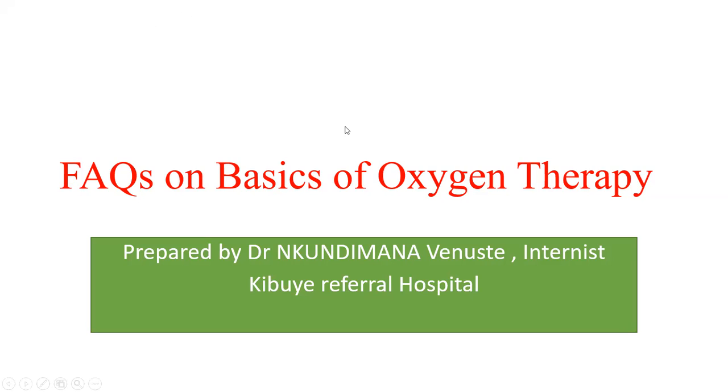Also, Felix asked what to do when SpO2 is still low on a high flow oxygen device. I'm not sure exactly what you want to ask, but when the SpO2 is low, you can increase the flow. Okay, thank you. If there are other questions, we are still accepting them. Let's keep with the basics of oxygenation.